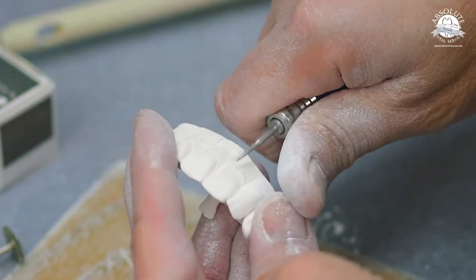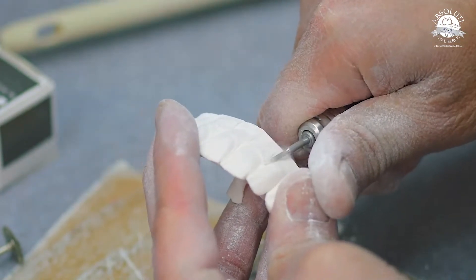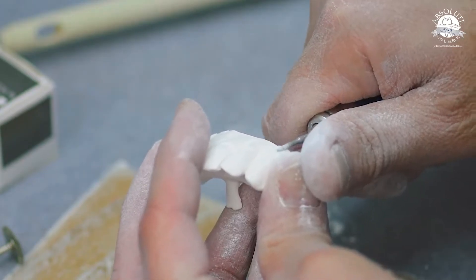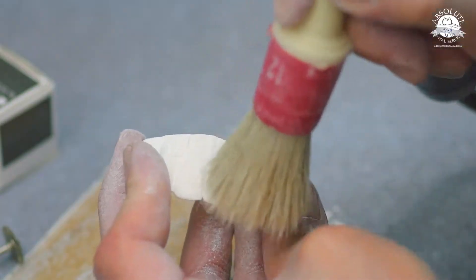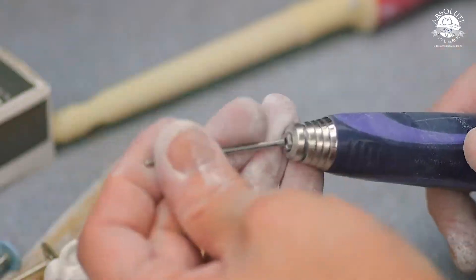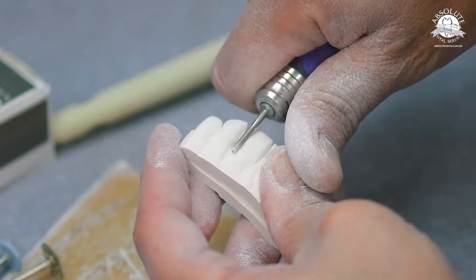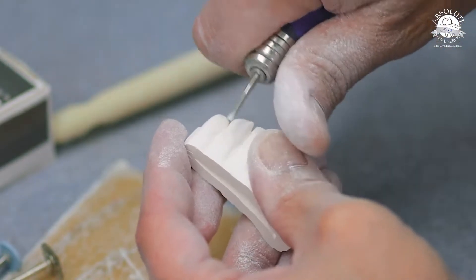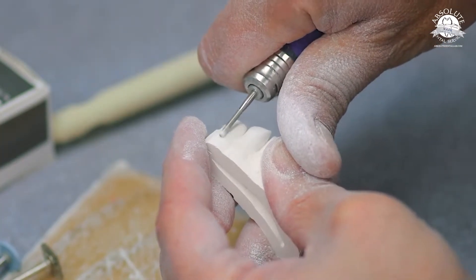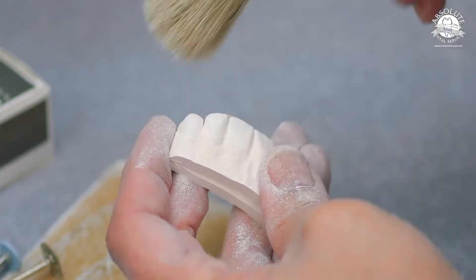Remember when cutting zirconia: the faster you go, the smoother it cuts; the slower you go, you risk chips. Make sure your burrs, diamonds, and carbides are all running true. Now I'm starting to define the gingiva a little bit more and starting to give it some texture.